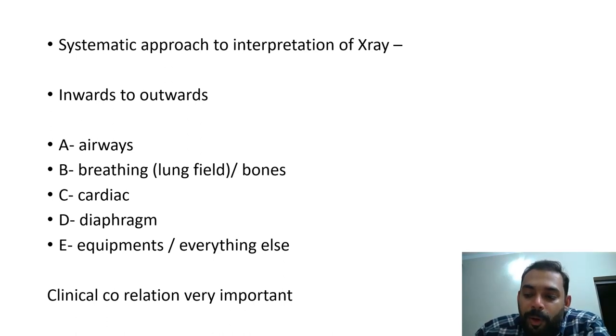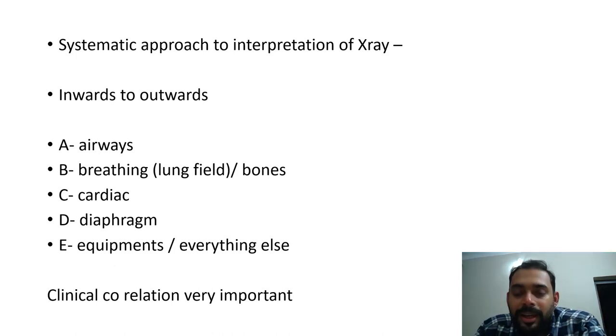Another important factor is to always clinically correlate when you read an X-ray. Always see what the patient has clinically, have a provisional diagnosis, and see whether it is fitting when you read an X-ray. So we'll go to A.